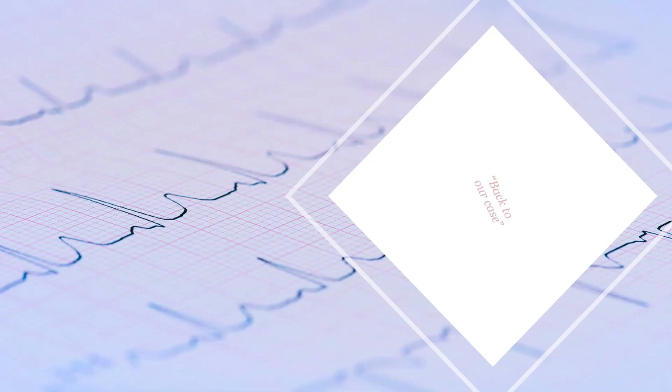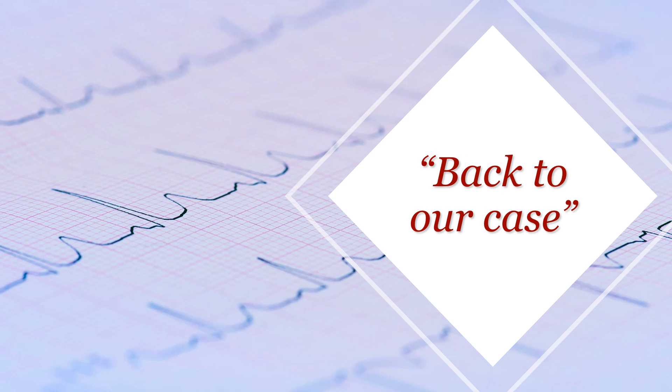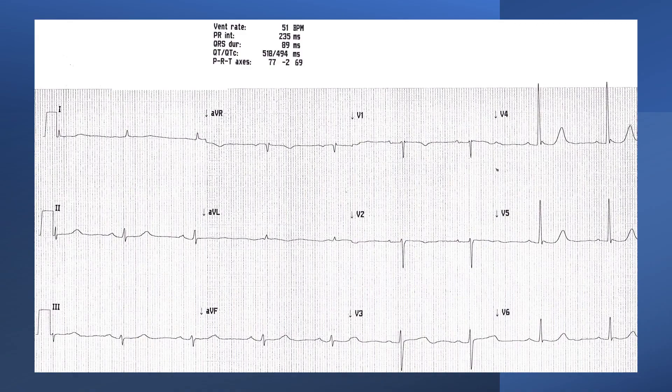Let's go back to our case and figure out what happened. This was the ECG. What we can see here is sinus brady, first degree heart block, low voltage ECG especially in the limb leads (I, II, III, AVR, AVL, AVF), long QTc, and T wave inversion in AVL, V1 and V2. This is what raised the suspicion that this is a likely hypothyroid case.